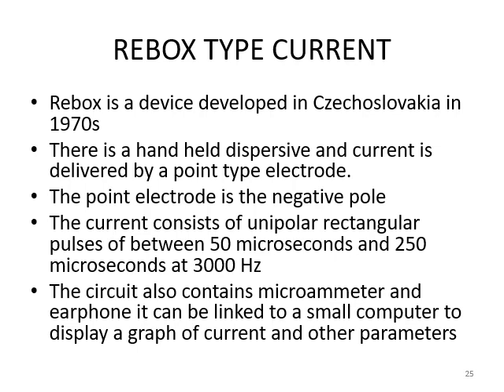The system may also be connected through a computer to a display where a current graph can be seen and even other parameter output can be seen. The device is primarily utilized to find out the response of tissues to the current, and as a healing response or outcome is seen, the waveform of current and the sound quality change, which provides feedback to the therapist.